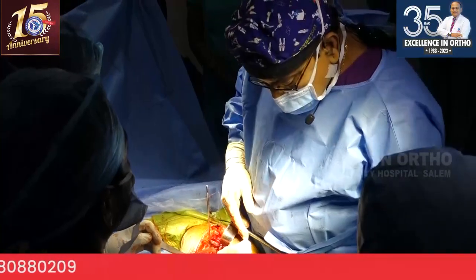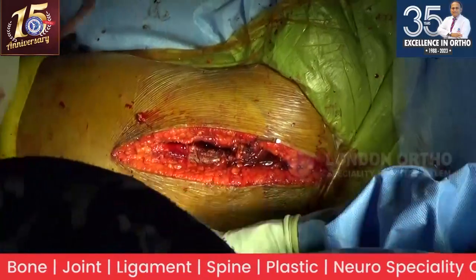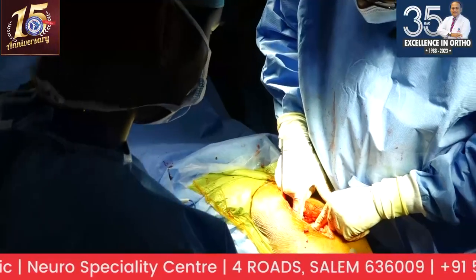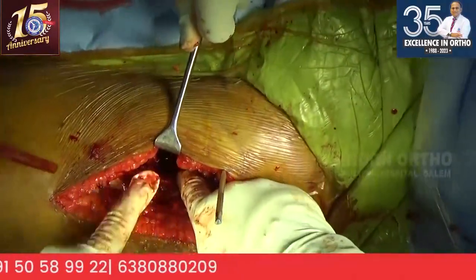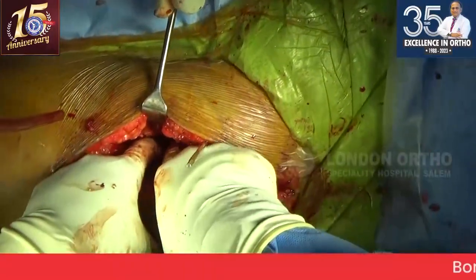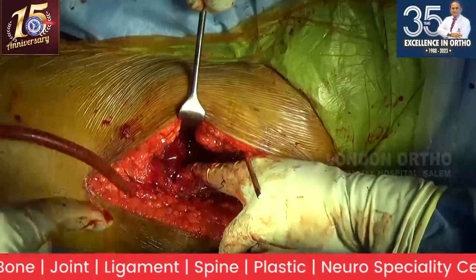Okay. Give traction. I just want to see how much I'm able to pull it down. So that's I am on the tip of the trochanter. Yeah, traction, traction. Okay, nearly 10 millimeter, 12 millimeter below the rim of the acetabulum. I think that should be the length restored. That will almost point to the center of the head. Okay, not too bad. I don't think I need to do any more extensive release. I'll just do the femoral side release a bit when I come to the femur.